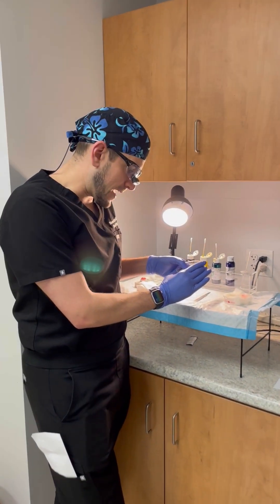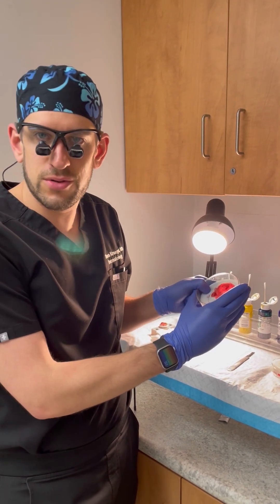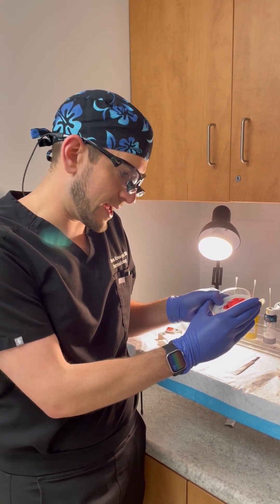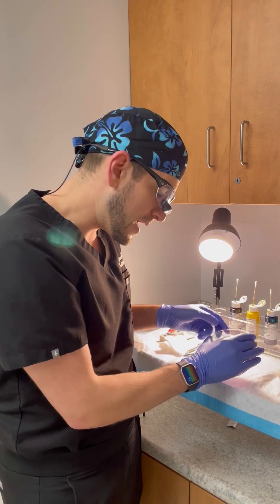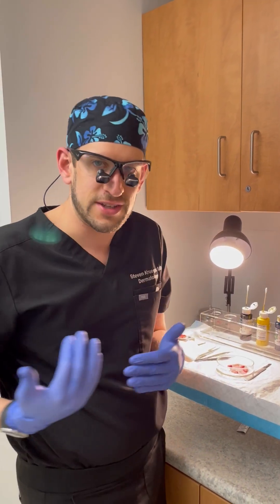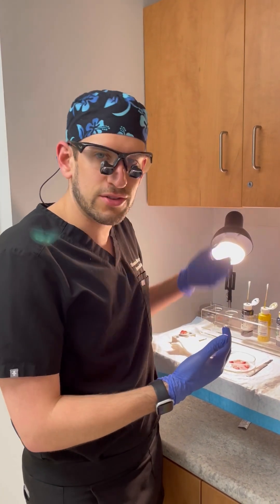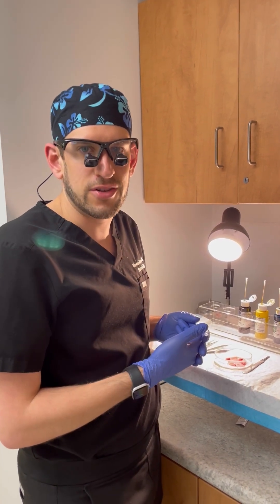At this stage of Mohs surgery, I just took the tissue from the patient that has the skin cancer in the center plus a margin of healthy appearing skin around it. I'm now taking it off to the grossing station to get it ready for the tech to section through the tissue and create slides for me to look at under the microscope.